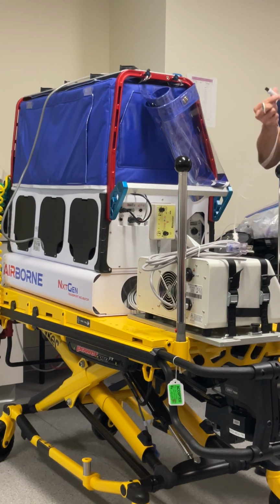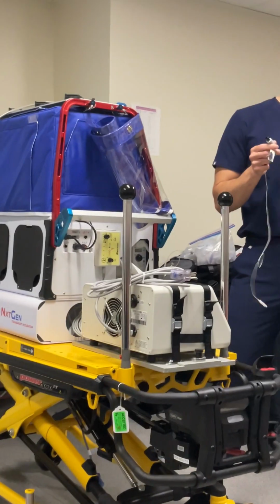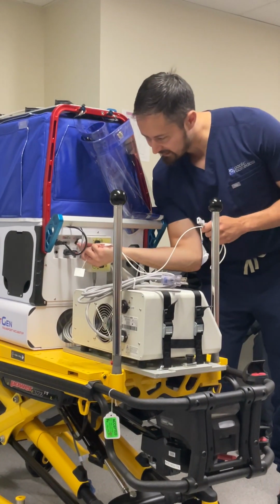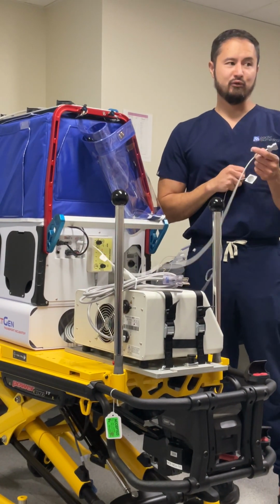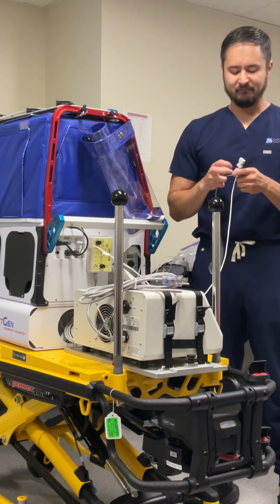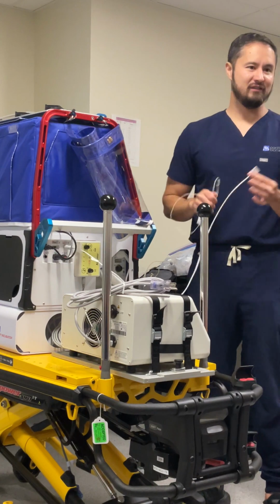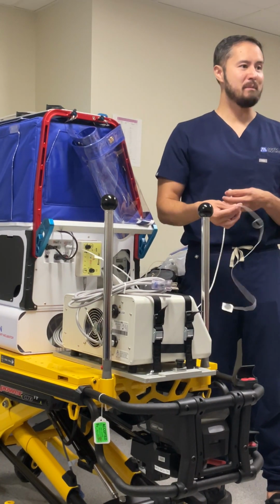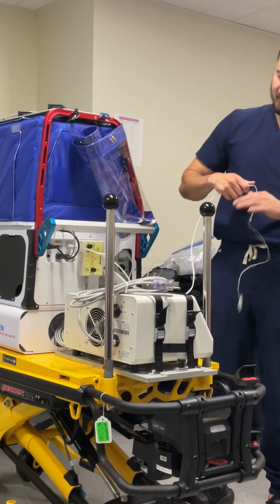Okay, so this is the new servo temp probe. So now the chamber will actually servo temp control for the patient. This is the patient end. I must inform you guys, this is the reusable side. So don't throw this away, because as of right now, in the entire time I've been doing this, it has been getting thrown away a fair amount. This is the disposable end to connect.